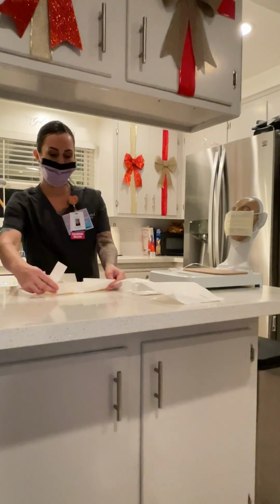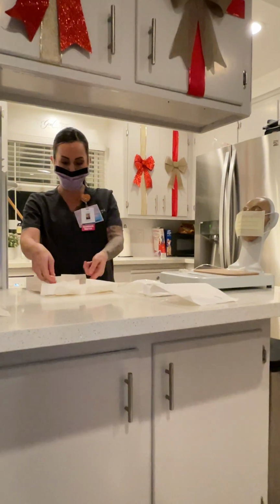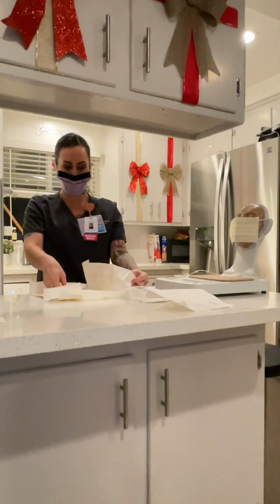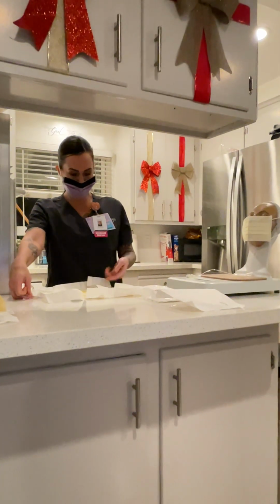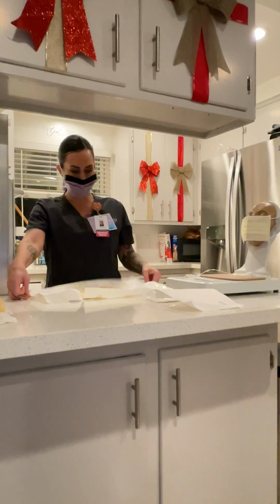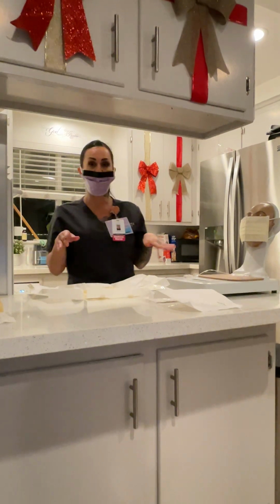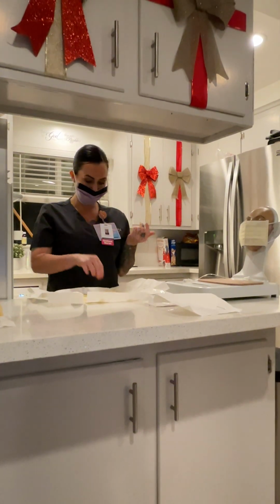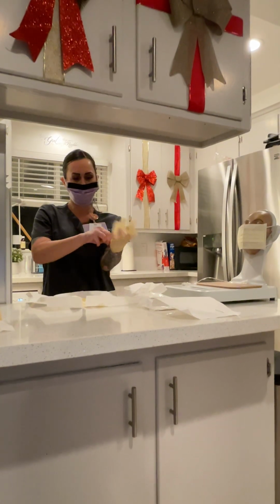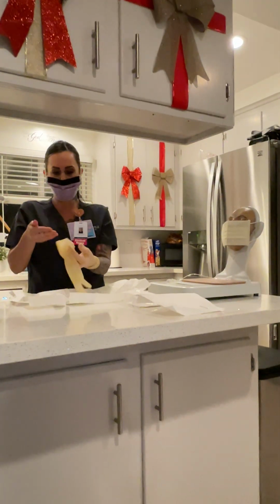You want to only touch the 1-inch border to open them up. You want to start by putting gloves on your non-dominant hand first. And then you're going to want to do the dominant hand.